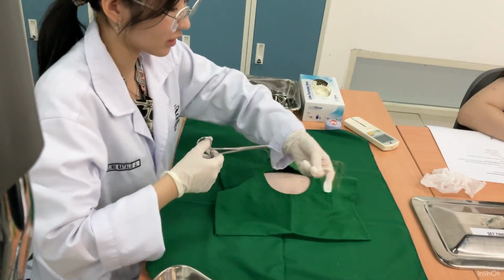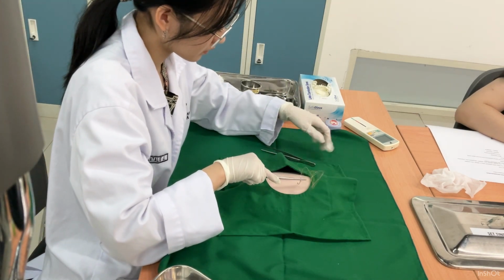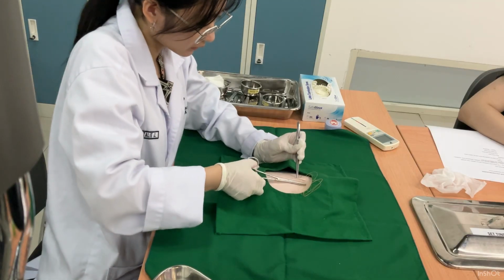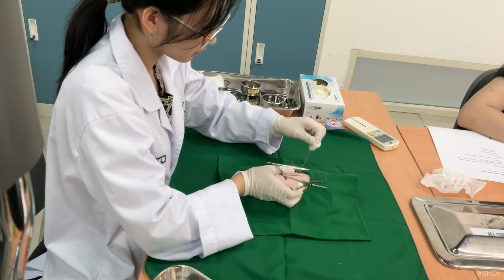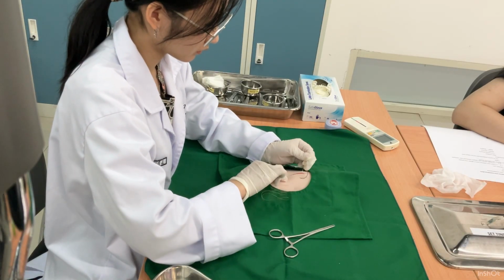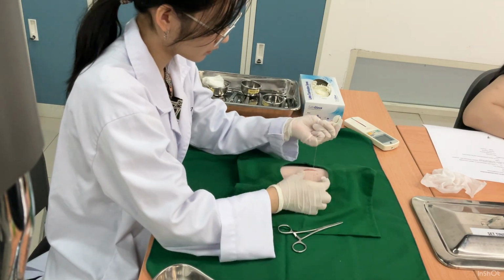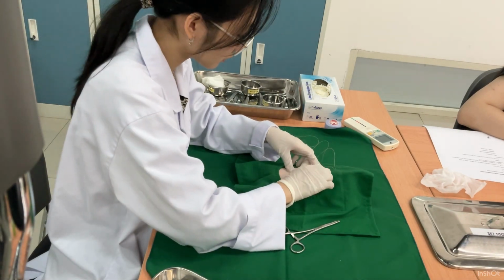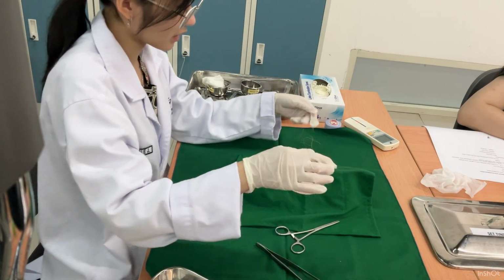Okay, so I will be inserting the needle now. Okay, next I will take the needle again.